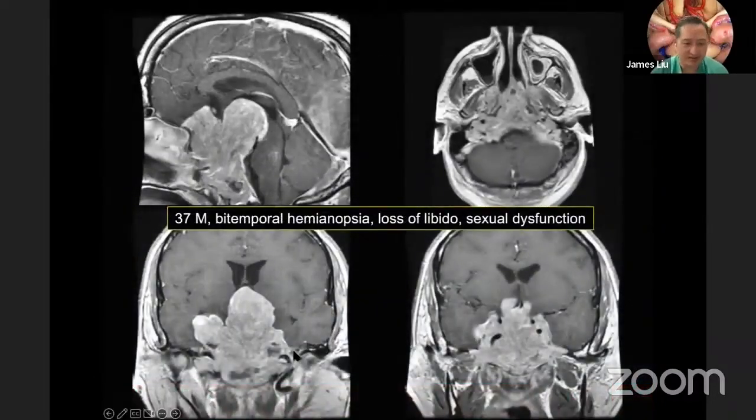What about this giant tumor? This is a giant tumor extending through the petrous apex of the skull base, invading the bone, very invasive with this cobblestoning effect. This is a very challenging tumor. How would one approach this surgically?